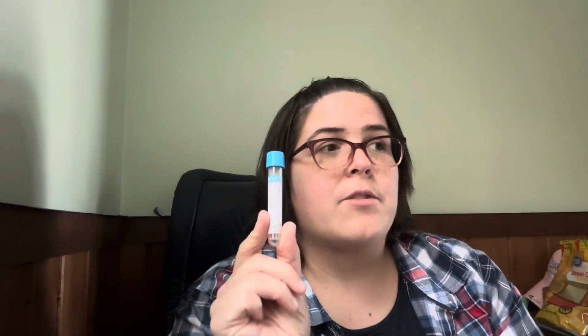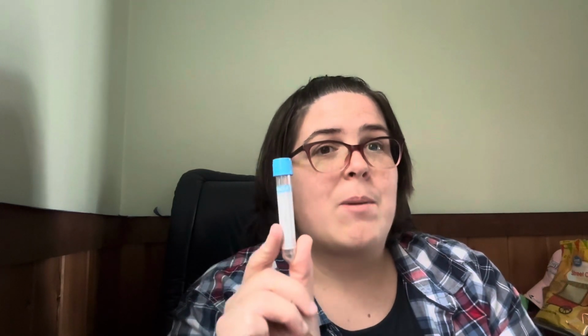So most of the time I only have to do these, but there are certain ones where it's a send out and there's multiple tests that they're going to run off of one tube. So I end up doing a tall tube just to make sure that they have enough to run all of the tests, if that makes sense. So after this, then we have the blue tube. I've literally only used this in the clinic maybe 2 or 3 times total for blood draws. And these would be for your coagulation studies and things like that.